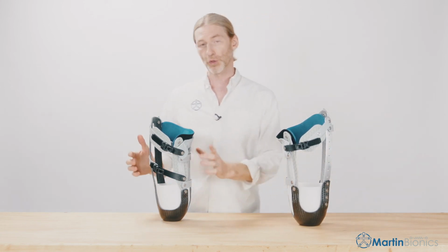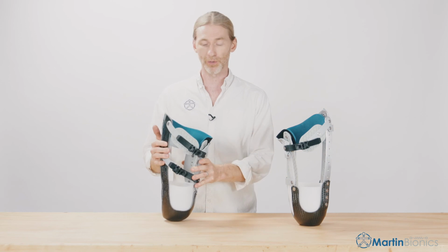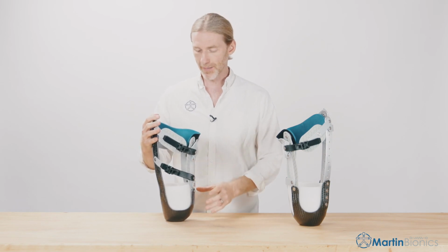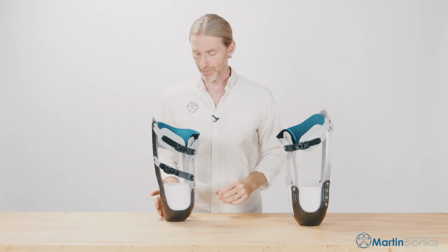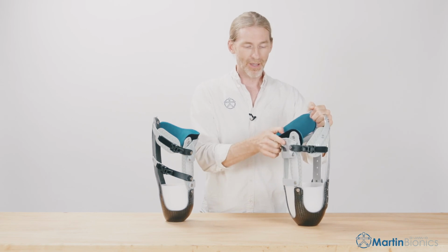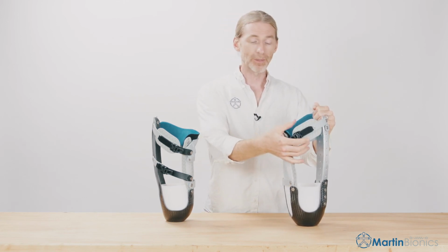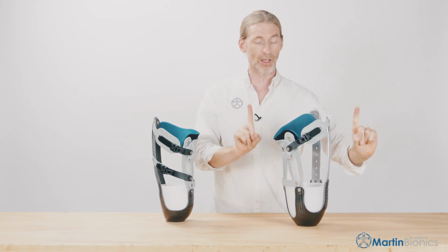Alternatively, we can replace our aluminum struts with a long loop lamination. So this is very similar to the original CX design, very low profile, really pretty simple transfer process. Just a matter of your preference from a cosmetic standpoint, or whichever fabrication approach fits your clinic better. But both of these sockets are equally as comfortable as the full CX design in the brim and the medial panel. The conformity to the body is super dynamic. In fact, I'd probably say that the CX Hybrid design has a little bit more conformity, more volume accommodation than the CX design, even because of the way we're wrapping around the whole limb versus the opposing struts.